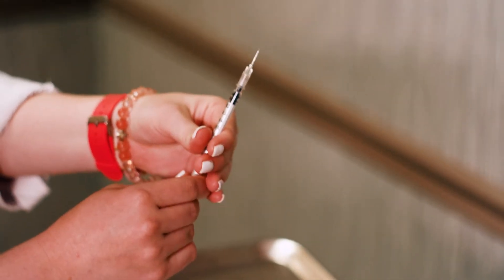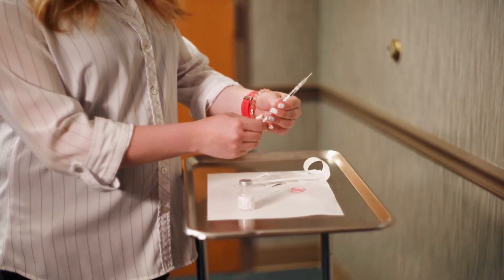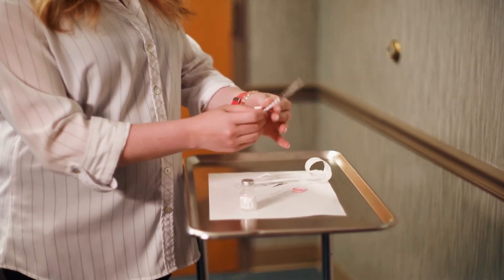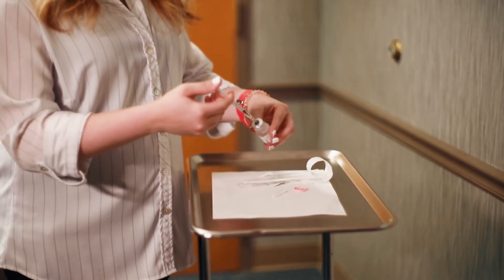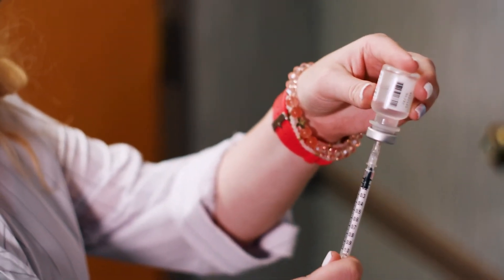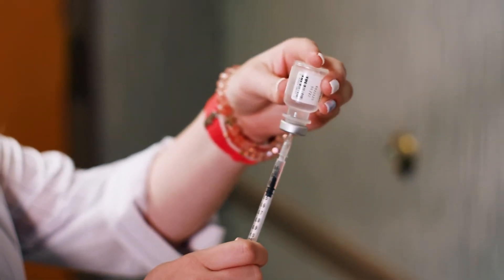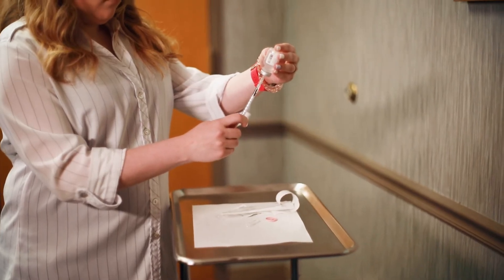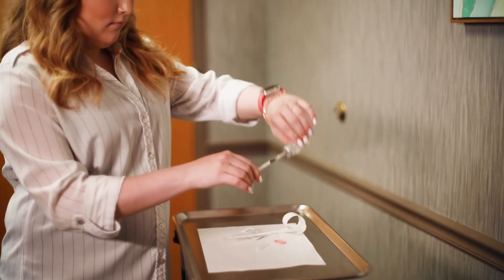Pull back the plunger of the syringe and draw air into the syringe equal to the amount of the medicine. Put the needle into the rubber top of the medicine bottle and push the air into the bottle. When the needle is still in the bottle, turn the bottle upside down, hold the bottle in your hand, and support the needle so it does not bend. Pull back on the plunger to the amount of medicine ordered. Pull the needle and syringe out of the vial.